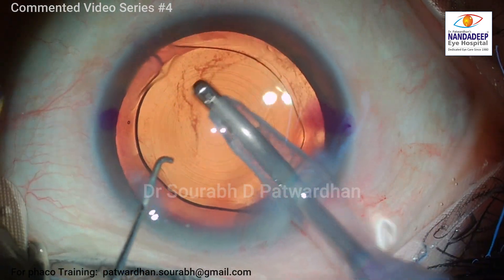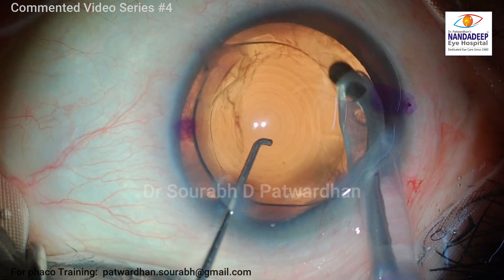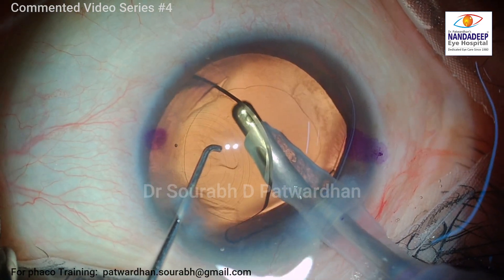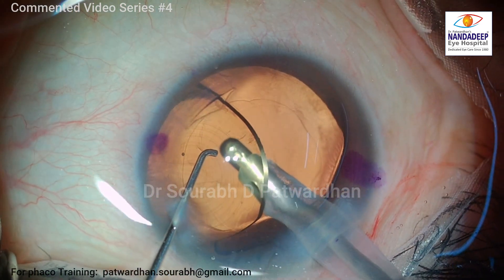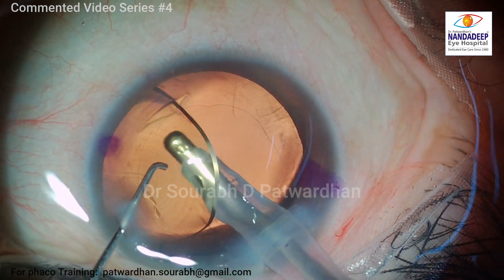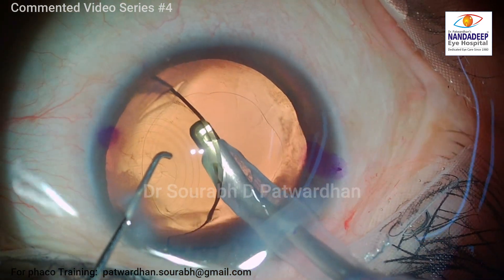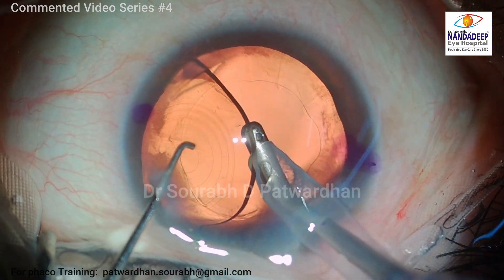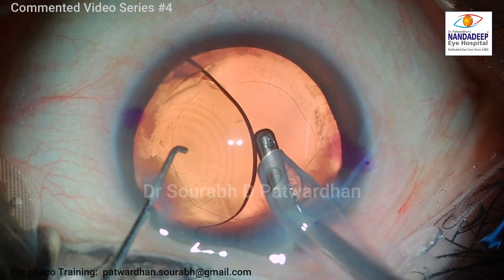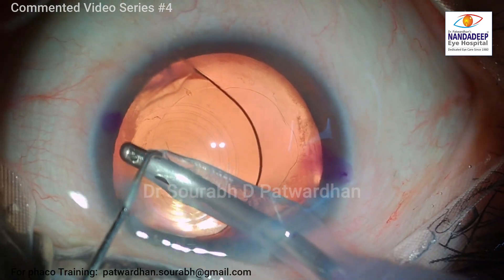Careful visco wash is important, just like any other case, and particularly if you have used chondroitin-containing OVD, as I have in this case. You have to be very thorough with the wash, otherwise there might be increased inflammation in the post-operative period and raised IOP. Also, if the OVD remains stuck to the posterior surface of the IOL or in the bag, it may lead to capsular distension and a myopic shift early post-operatively.